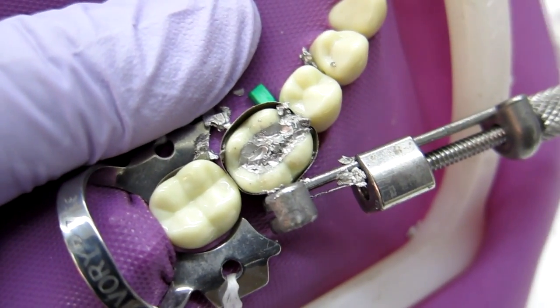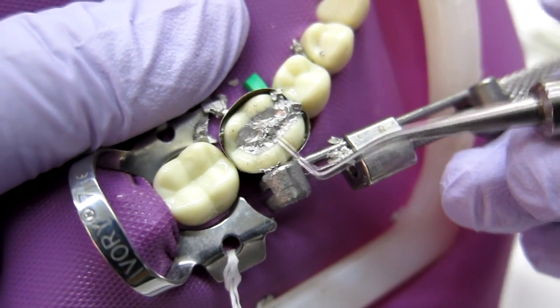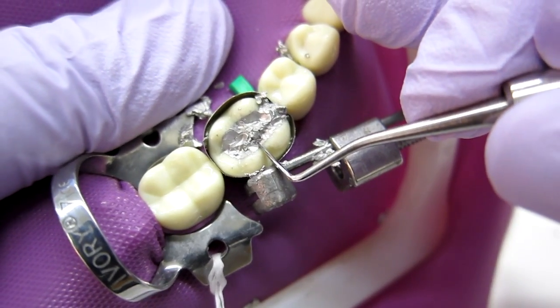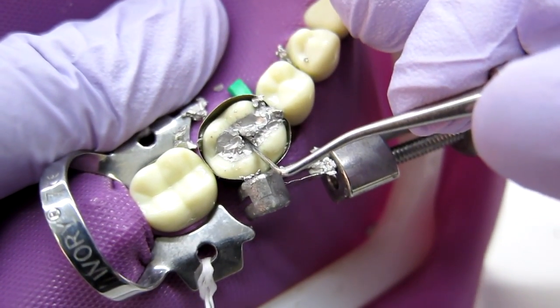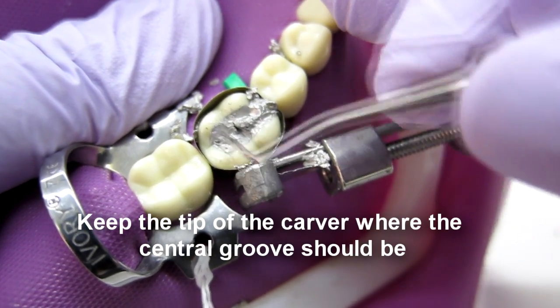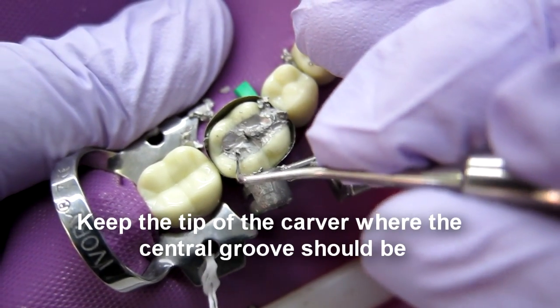The first thing I like doing is using carvers — the Hollenbeck is my favorite because it's nice and long. Do as much as you can with the band still on, so it gives you more time to work. I'm going to start here with this groove and, keeping the instrument on the tooth structure, I'm going to carve across.